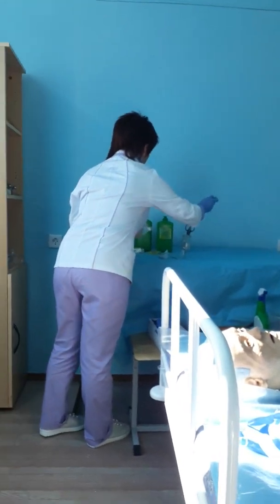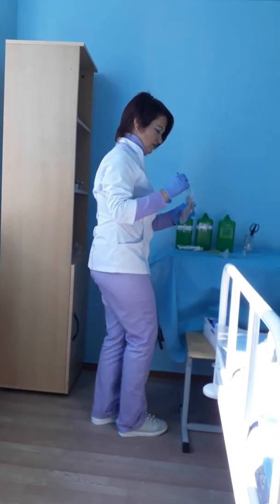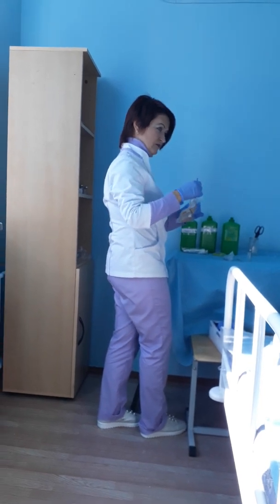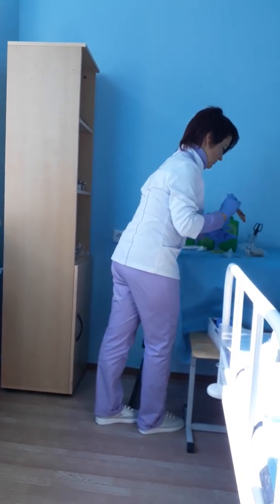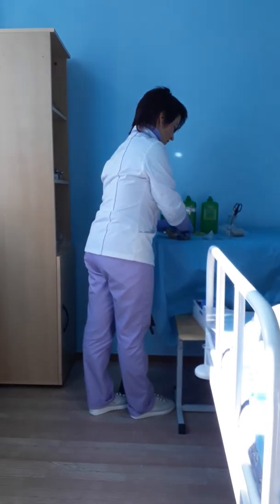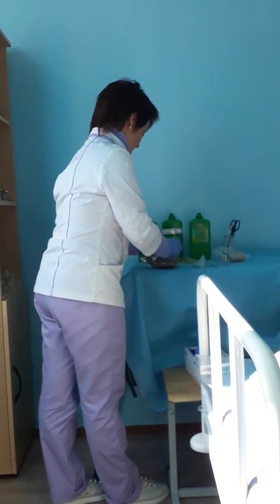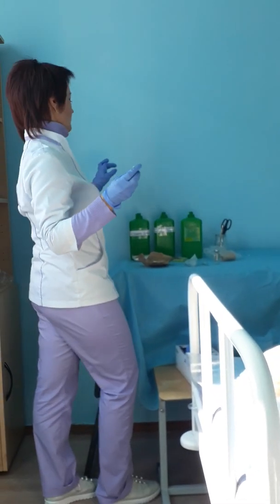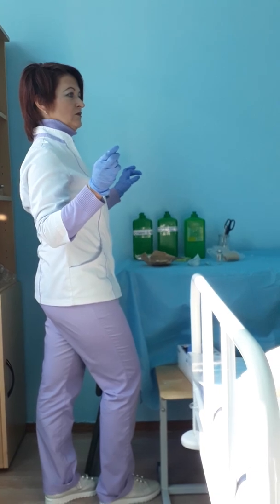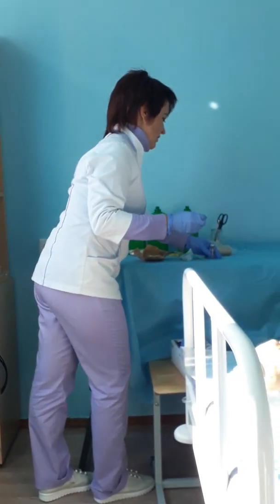You can comment on what I'm doing now. Prepare sterile material. Now I clean the vial. What solution must I use? An antiseptic for the ampoule or vial.